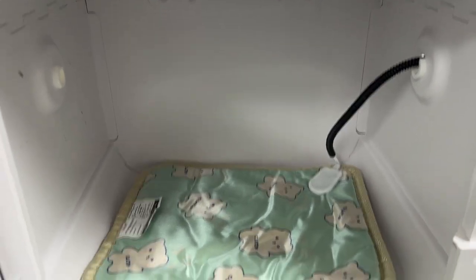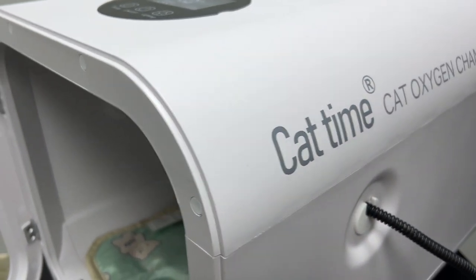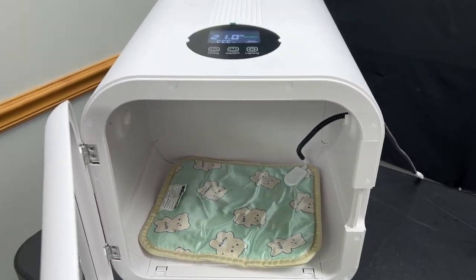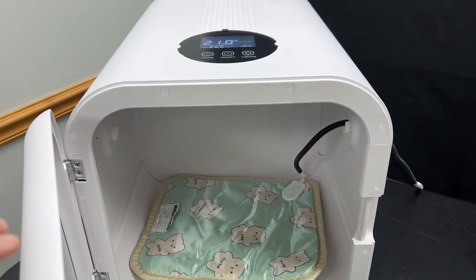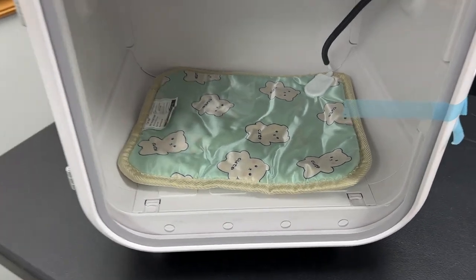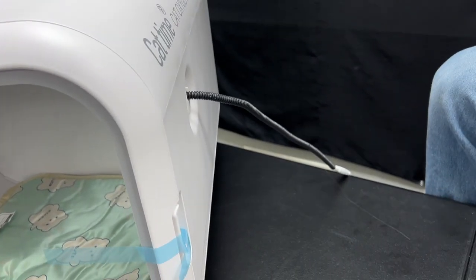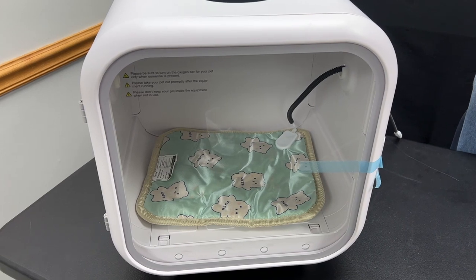On the side there are ports on both the left and right side for adding atomizers for airborne drugs or for adding humidity. These items are not included with the unit and will have to be purchased separately. Included with the device is a warming pad which can be routed through the side port, and it is braided with a plastic wrap to prevent puppies from biting it and exposing themselves to electricity.